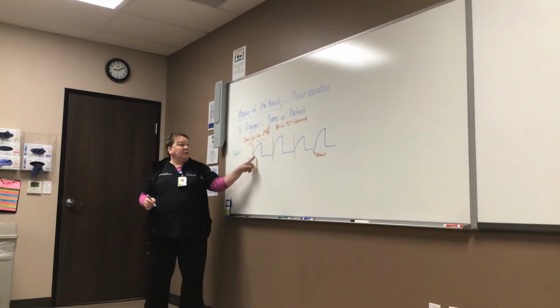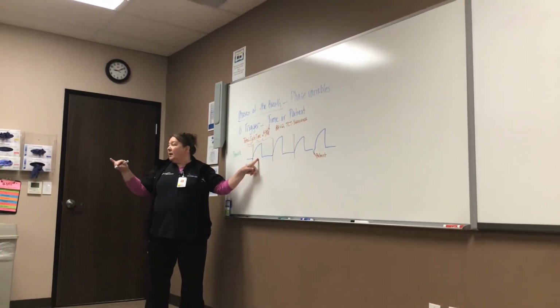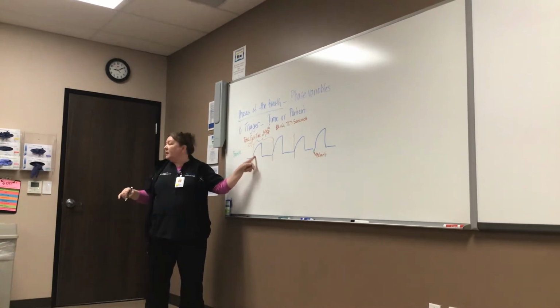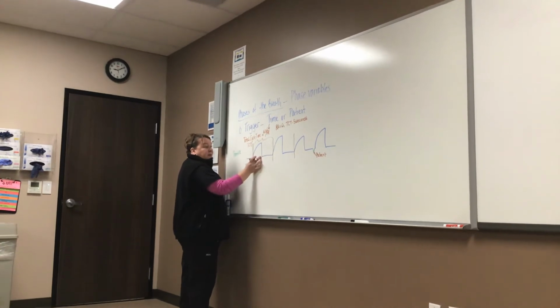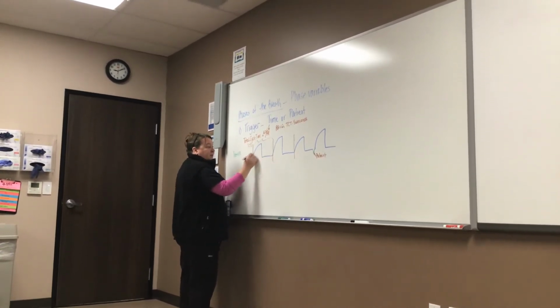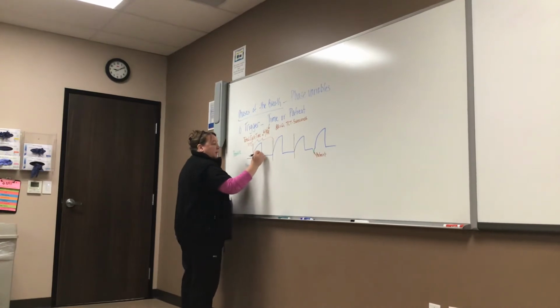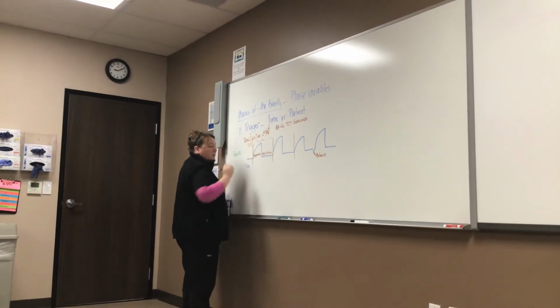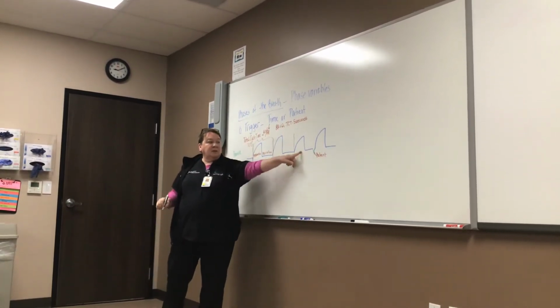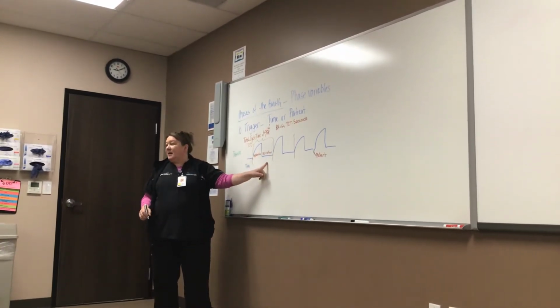And then within that total cycle time, what has to happen? Right, so, Carl, what does that compose of, though? Inspiratory and expiratory. Correct. So on this little waveform that I drew, this is inspiratory, this is expiratory. This is going to be inspiration, and this is expiration. Inspiration, expiration, inspiration, expiration. So within here, your breath has to be delivered and your patient has to have time to exhale.